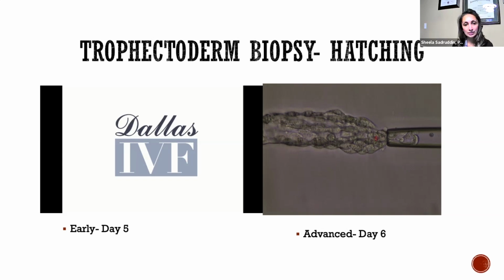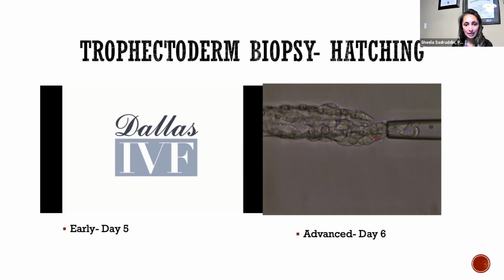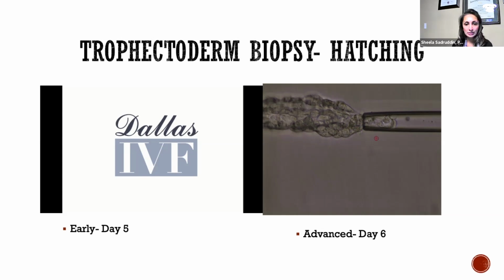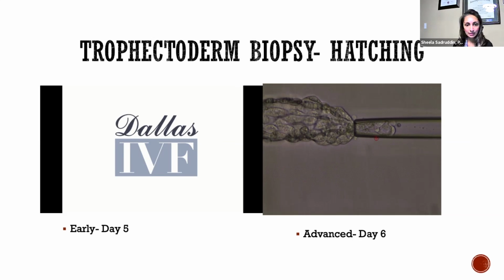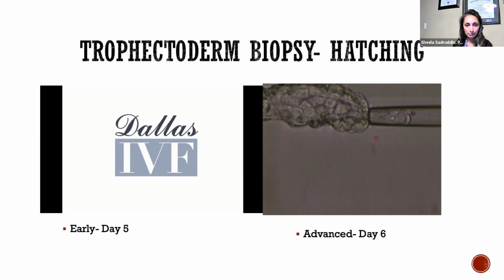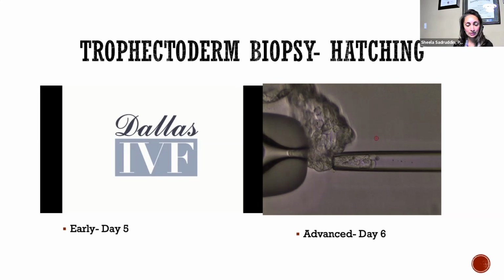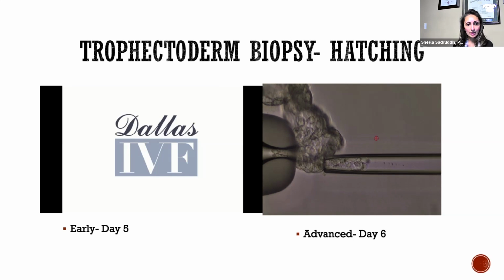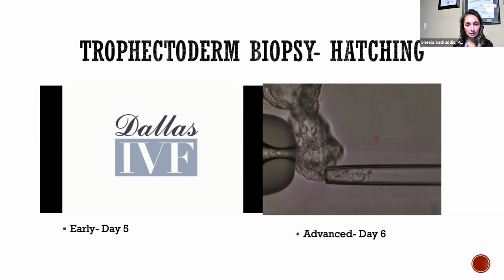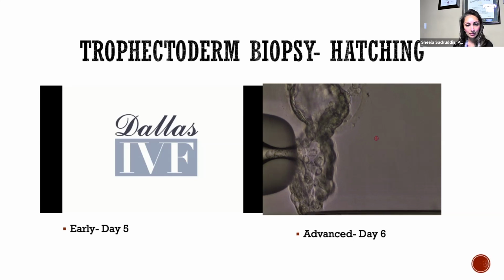And then once you get that stretch and you see those junctions, you want to hit those junction points and you see perforation. And once you're perforated through from the top to the bottom, then relax a little, pull your cells into the embryo biopsy pipette, and then a quick pull away should get your embryo biopsy to fall off.